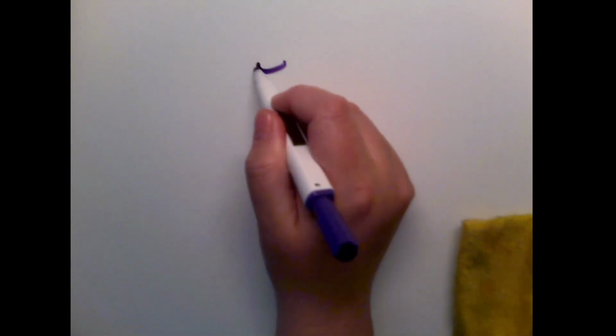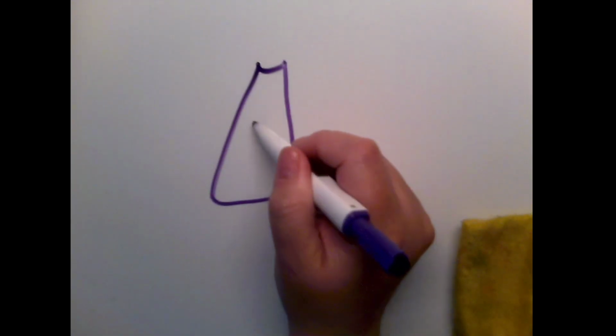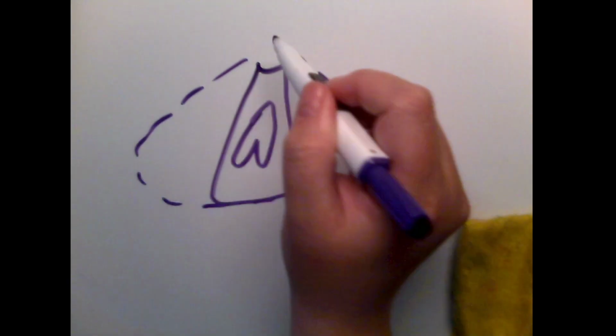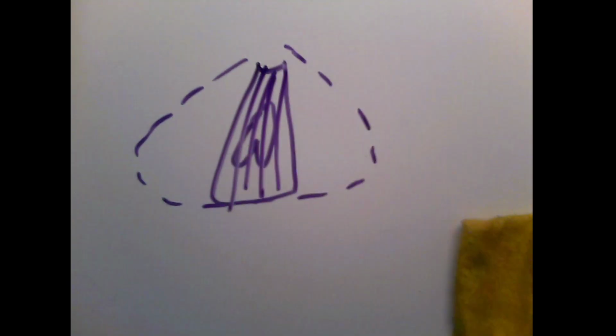The opposite of that then is we can bring that sector in. And if this is our structure, remember it was out like this before, but now we're just using the scan lines for this small area. We can produce these fewer scan lines much quicker and have an improved frame rate.